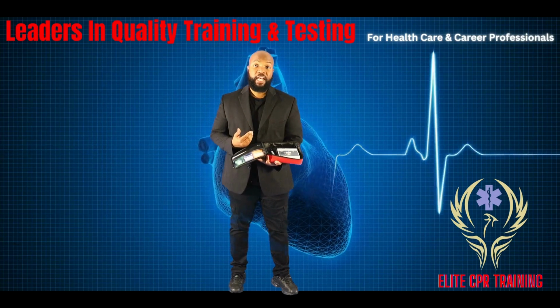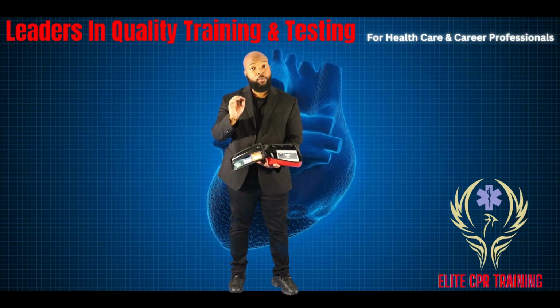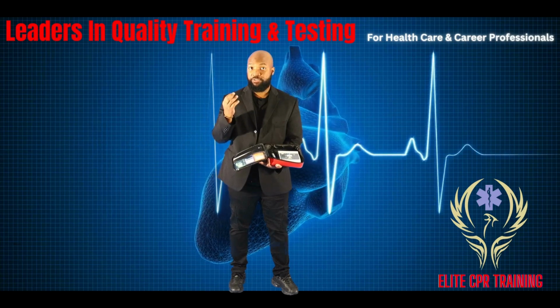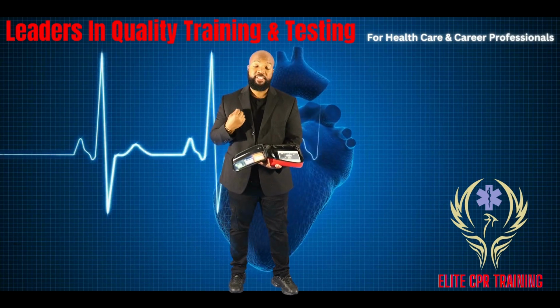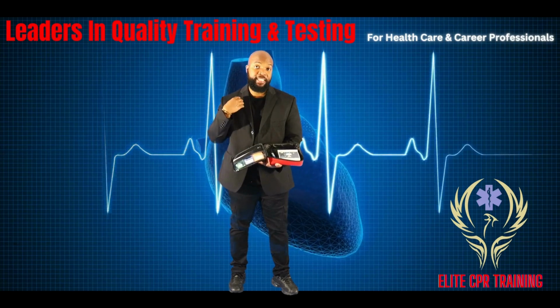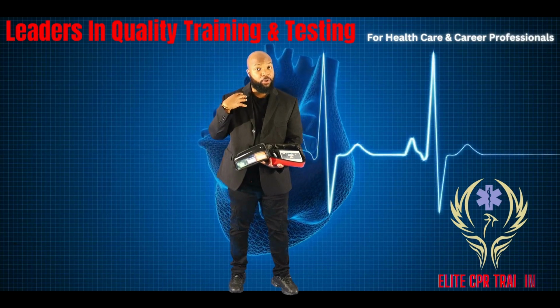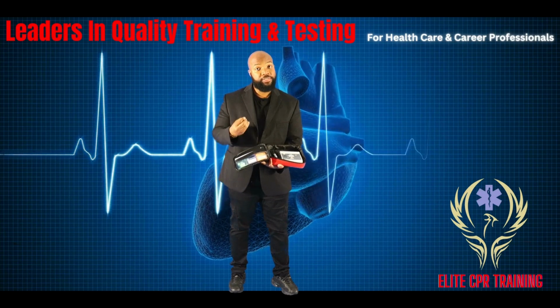If the person happens to have a medicine patch, you want to peel off the medicine patch. Remember to always use your gloves because that medicine can travel through your skin. So pull off the medicine patch and go ahead and wipe it off. If the person happens to have an implanted pacemaker or some type of shunt or anything that's below the right clavicle, you can still use the AED.